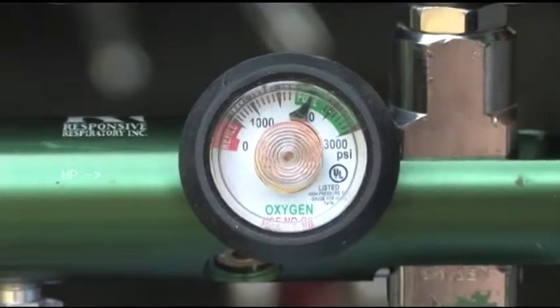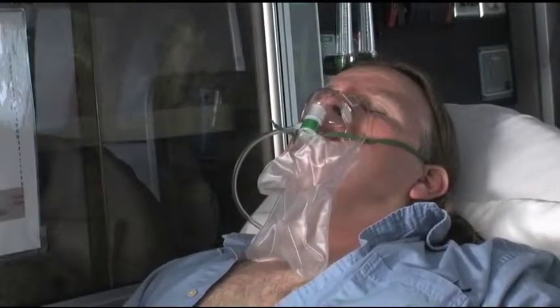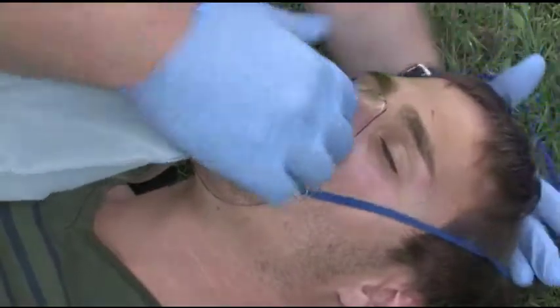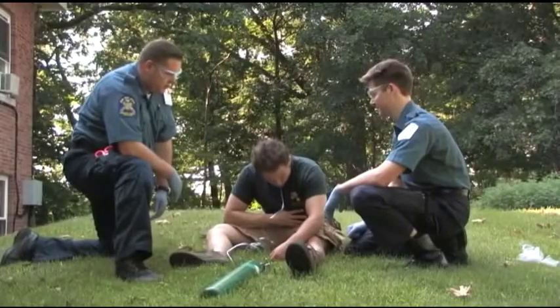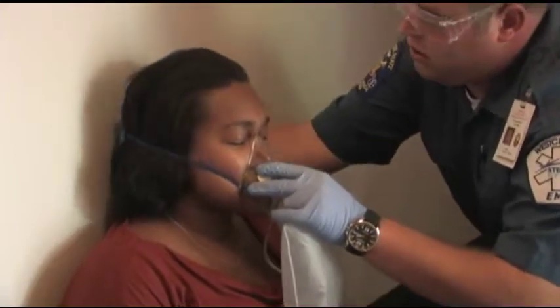Administration of oxygen is one of the most important treatments that an EMT can give to a patient. The Earth's atmosphere provides about 21% oxygen. That's enough oxygen for a healthy person to function normally. As an EMT, however, you will come into contact with sick or injured people who often require supplemental oxygen.